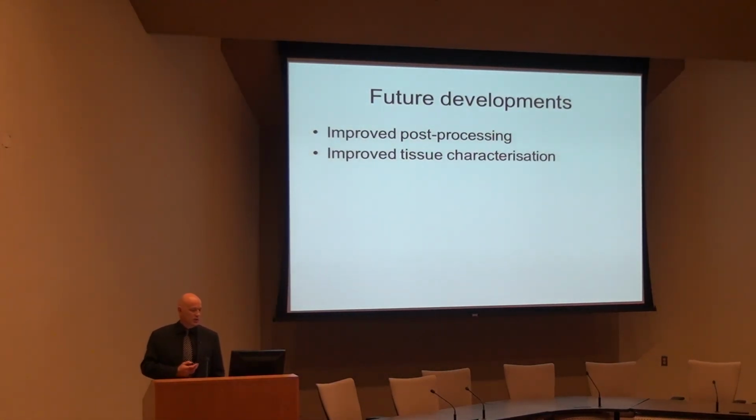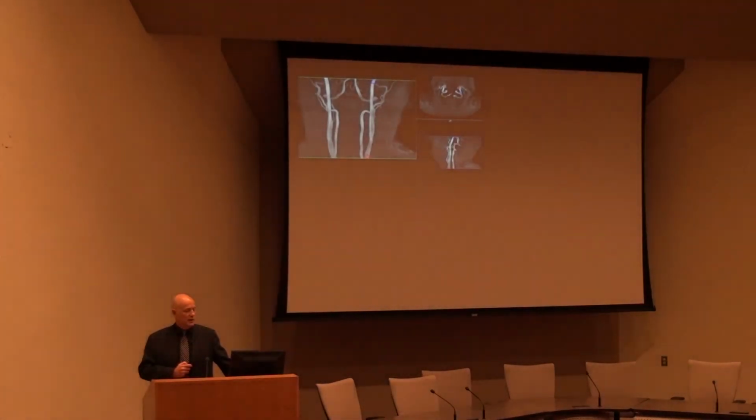Again, Jean-Claude mentioned that dealing with all of this data is a problem. We have to deal with it reproducibly and in a timely manner. I've already shown that these patients coming in are having a huge amount of data. They may have 6 sequences, both carotids, on multiple occasions, and we need to keep up with data processing. Improving tissue characterization as well. We have the technology there to look at different signal intensities.